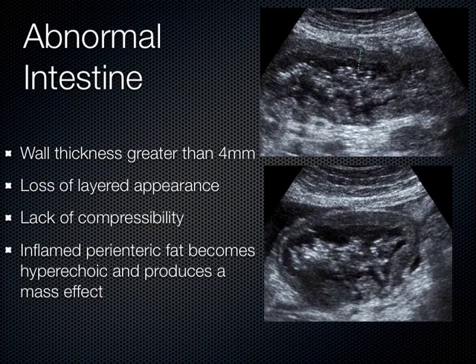Now, as you can see here, this is abnormal intestine. How do I know that? Well, I measured the wall thickness. We measure from the outside edge of the wall all the way down to where the lumen starts. And this is where the lumen is here. This is stool and feces and a little bit of air. These little punctate things here, that's probably air. Whenever I see dots on the screen, those are almost always air. And so the wall actually extends right to where the lumen starts, okay? So over here, the wall would start here, all the way down to where the lumen starts. In fact, down here, the lumen starts right about here, okay?